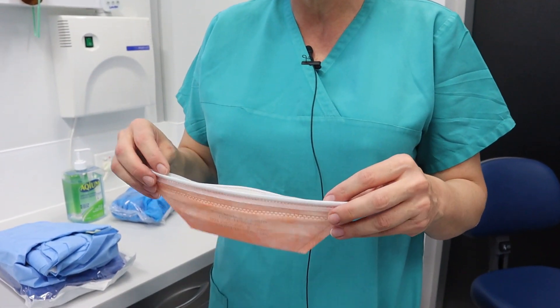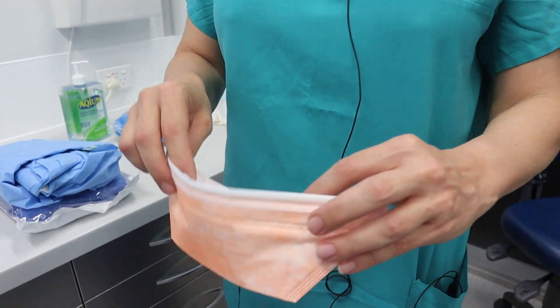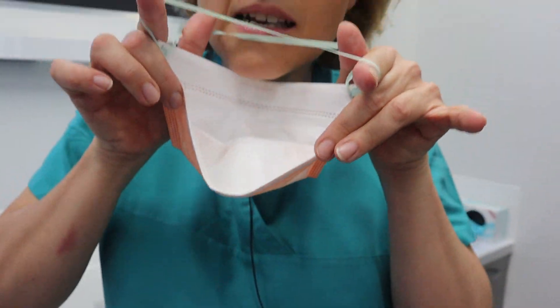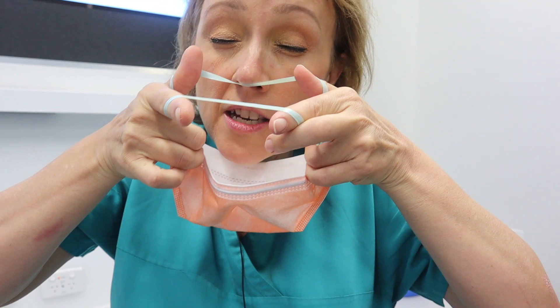On the duckbill, there's a bit of an art to this. First of all, we need to open it up, and you'll notice at the top there's a little metallic part that can be bent. Now it's a matter of cupping it under the chin and going over the face — there's quite a bit of an art to it.